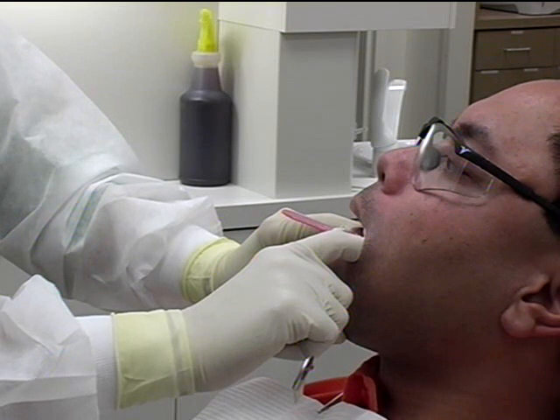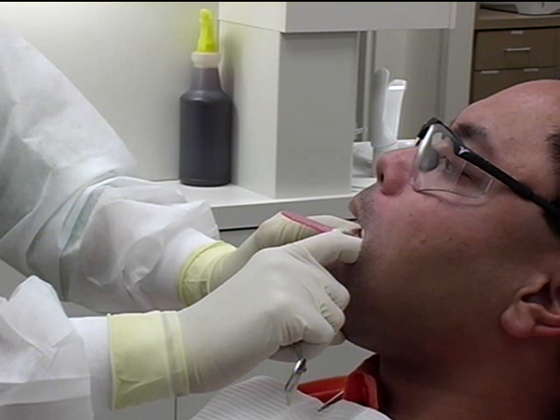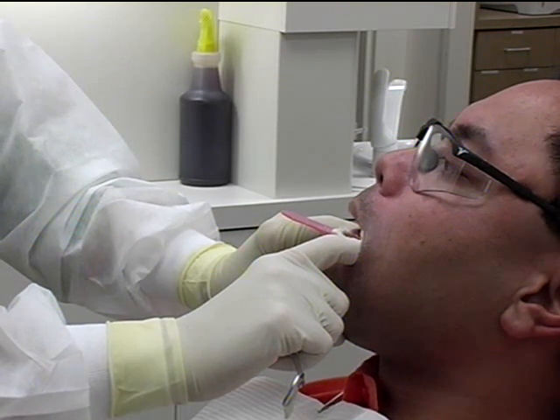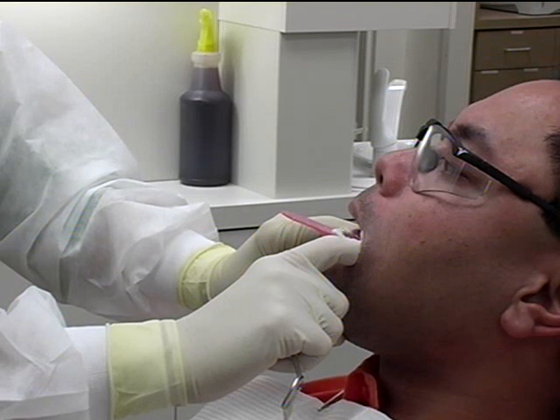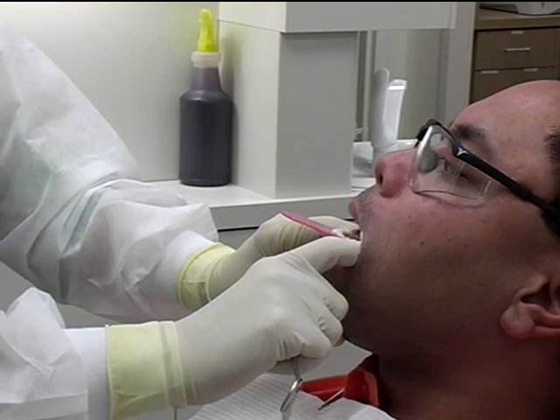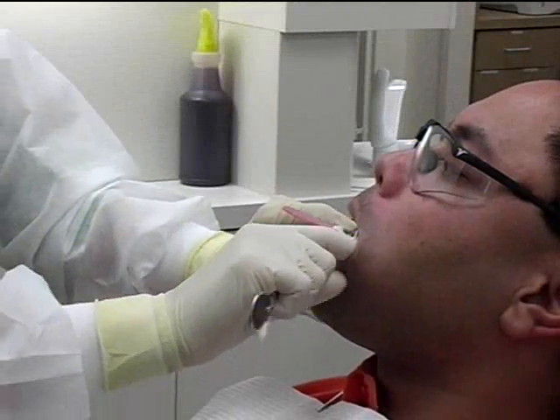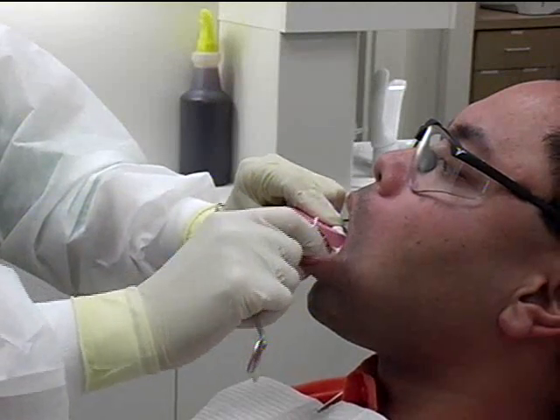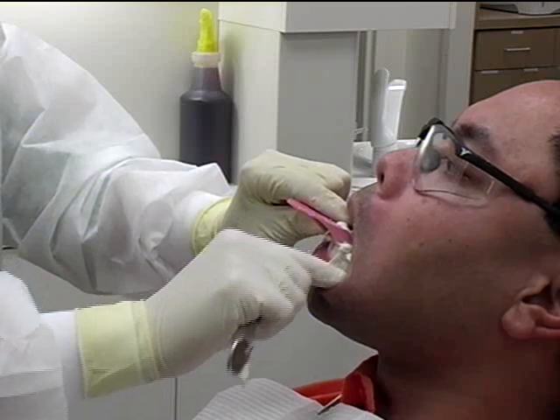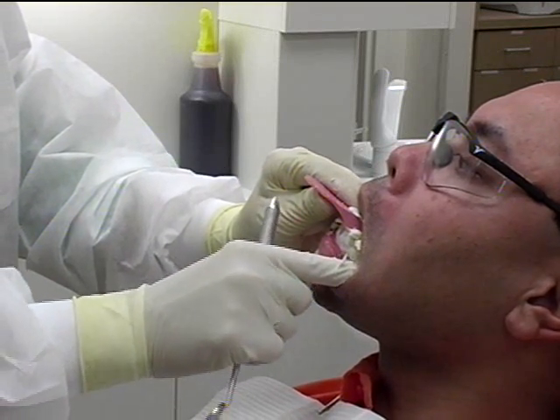Hold the tray in position. Pull the cheek and lip to mold the buccal and labial vestibule. Wait for 3 to 4 minutes to allow the material to set. Do not leave the patient unattended or the tray unsupported. Break the seal by gently pulling cheeks and lips outward, and remove the tray with a snapping motion.